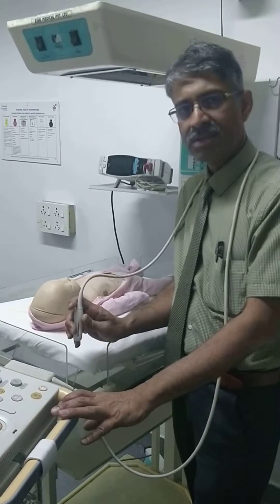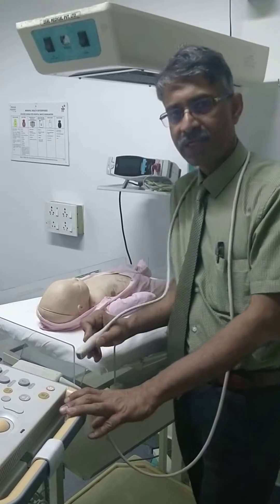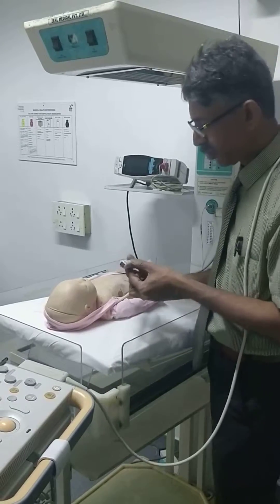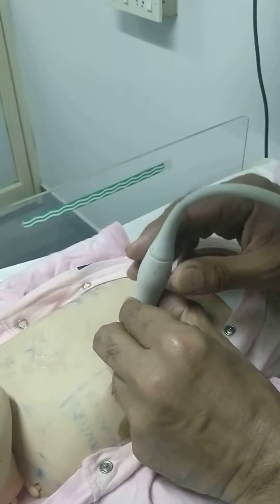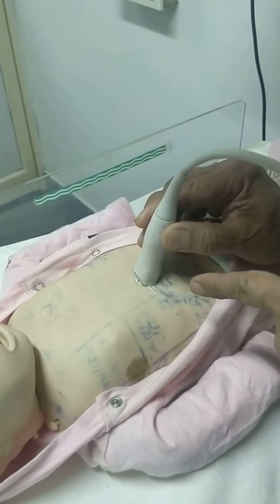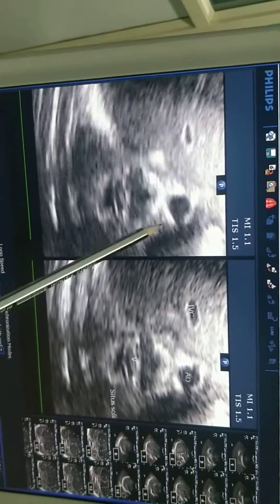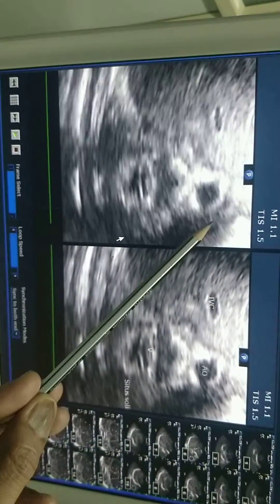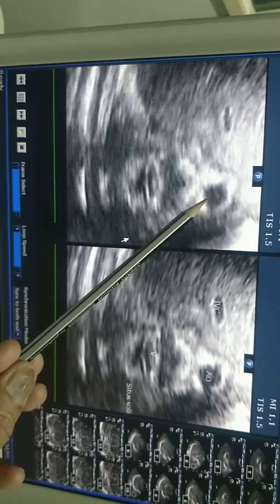To demonstrate venoatrial, looking at the situs is very important. To demonstrate the situs, I keep the probe in the subcostal area with a marker facing to the left. This is called subcostal coronal view. Here you see the hyperechogenic area — this is the vertebra. Anterior to that, you have a pulsatile structure, an anechoic area surrounded by hyperechogenic area. This is the aorta.